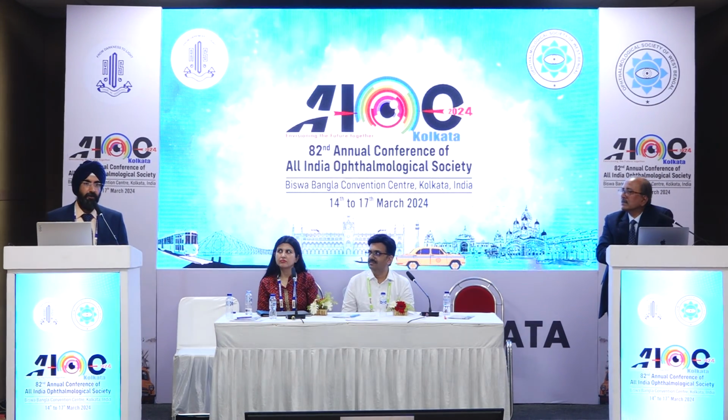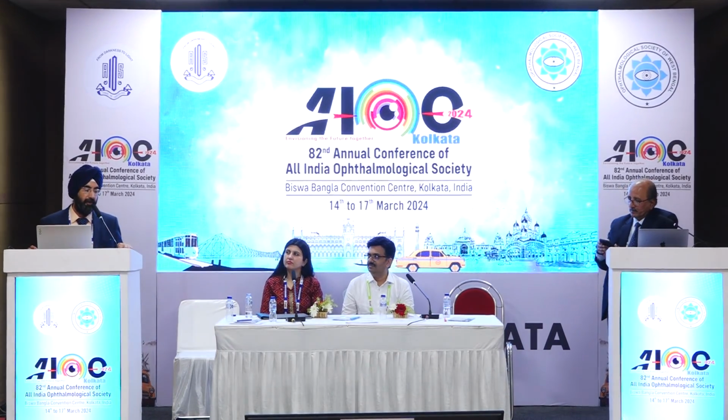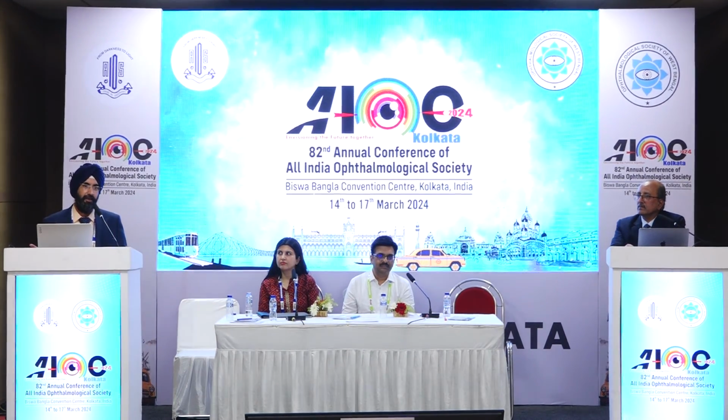The technique is, first of all, you don't have to be careful about the size of the anterior rhexis. Where they say it has to be very certain, because if you have to put the IOL in the bag you need the anterior capsule covering on the optic, here you don't have to be careful. So even if you have a large rhexis, it doesn't matter. But the important thing is the posterior rhexis. If you have a small posterior rhexis, you're going to tear it. In young children, in infants, it really doesn't matter. I've done so many cases with a small rhexis. It's so elastic that it just goes. But in older children, in my experience, if you don't have an appropriate size rhexis, say about 4 to 4.5 millimeters, there is a high possibility of tear. So you have to have a good size rhexis at that moment.